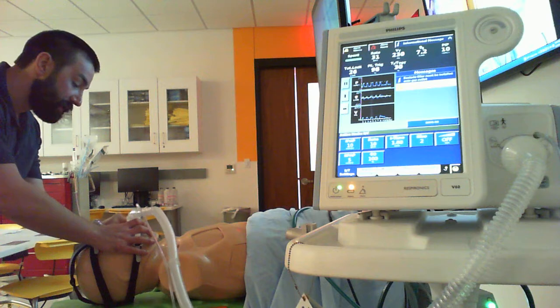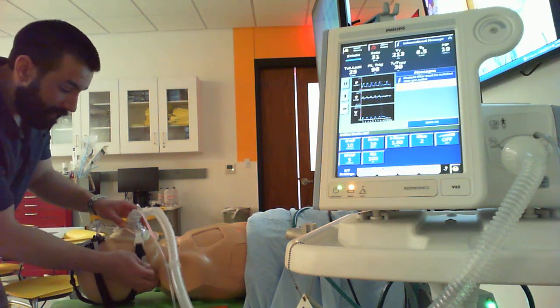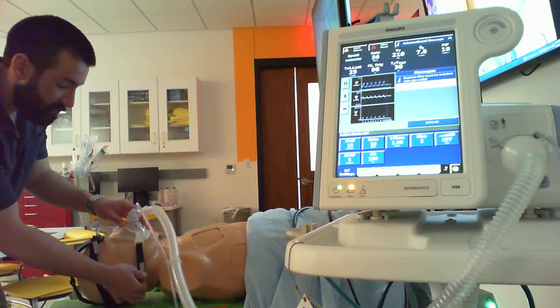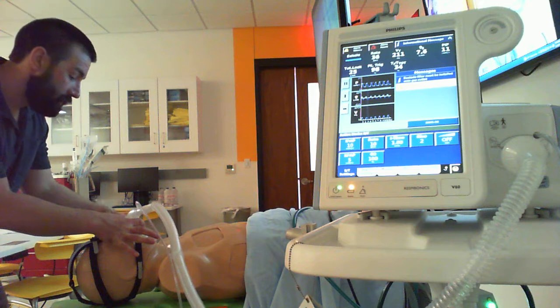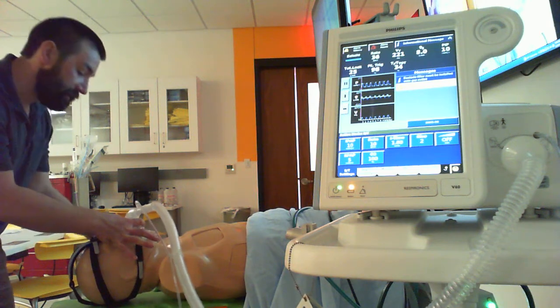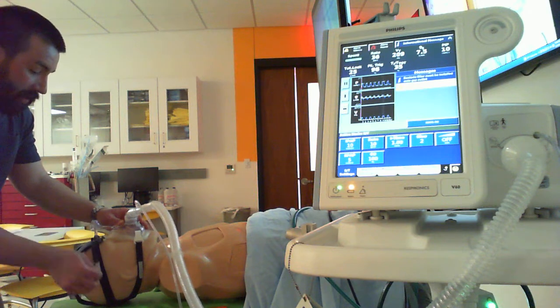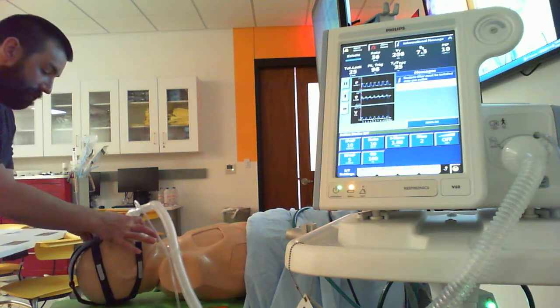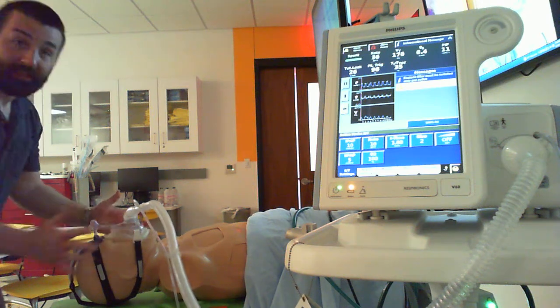I'm putting these quick release tabs on, and I try to avoid being on top of the ears and stuff. All I'm doing is holding one hand on the mask, and I'm pulling the slack out with these little Velcro tabs to hold my work in place. Okay, so I did that down low. I'm going to go ahead and do everything up top here, making sure my mask doesn't get all crazy.